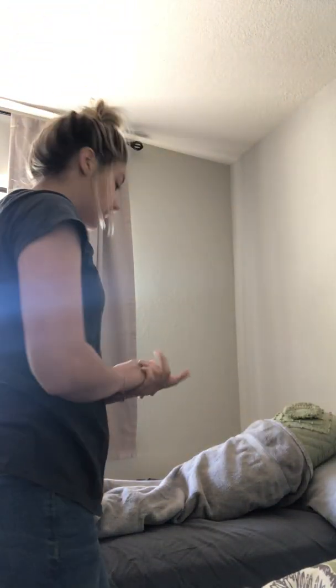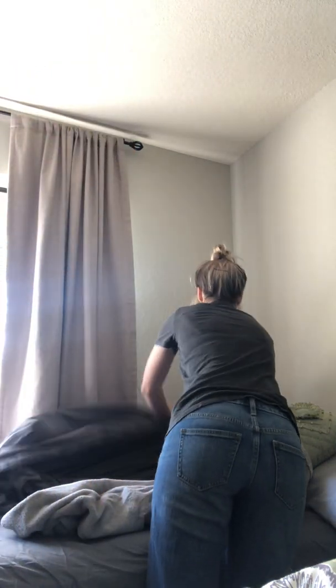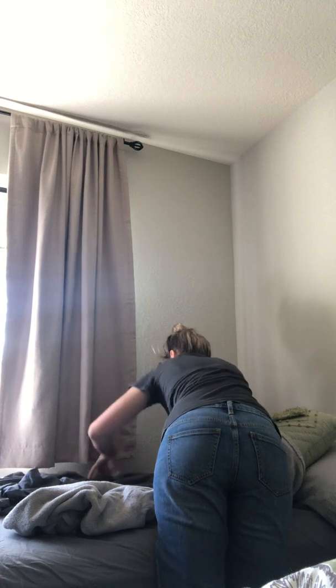Now that my dirty linens are off and disposed of, I'd practice proper hand hygiene. Then I'd proceed from the head of the bed and do the same on this side — tuck in my corners, and depending on the type of sheets, do a mitered corner.